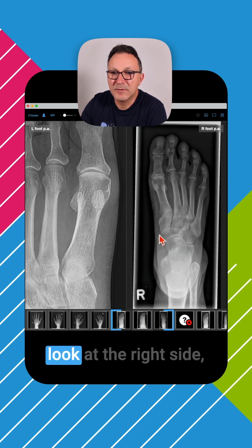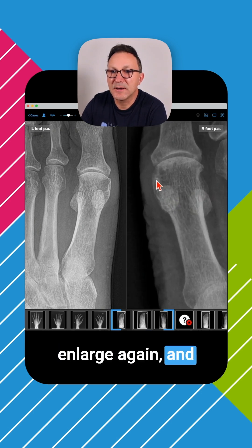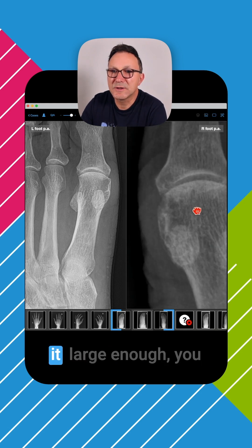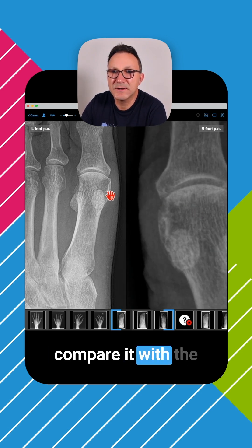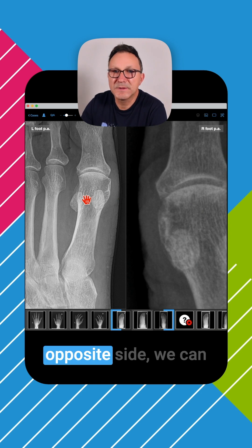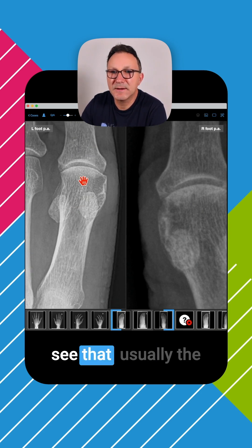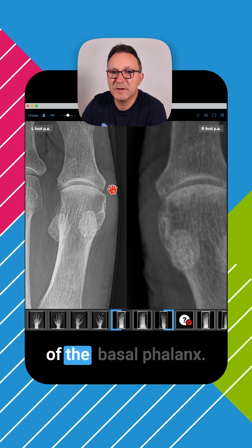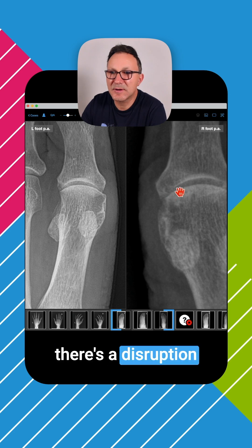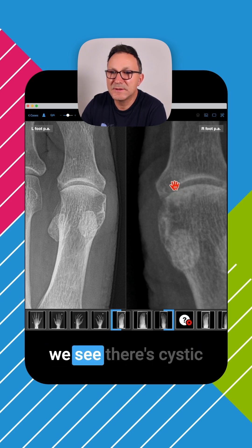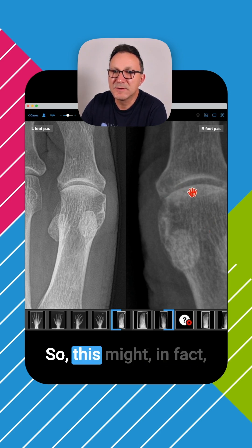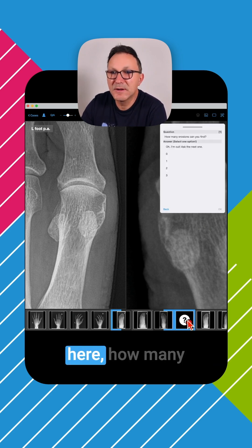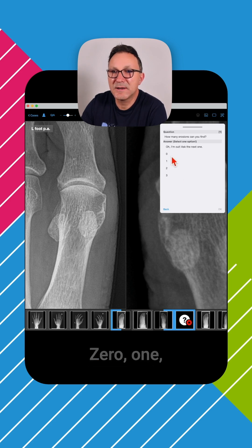Then again we look at the right side, enlarge it, and there are some cystic lesions over here. Even if you enlarge it enough and compare it with the opposite side, we can see that usually the cortical layer should extend to the medial edge of the basal phalanx — but here we see a disruption of the cortex and cystic changes. So this might in fact be an erosion as well. The question was: how many erosions are there — zero, one, two, or three?